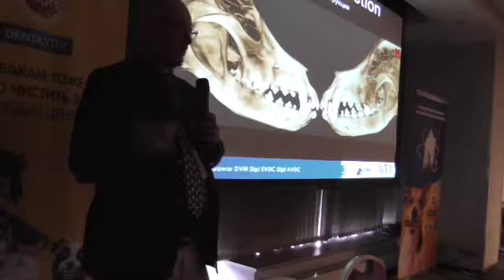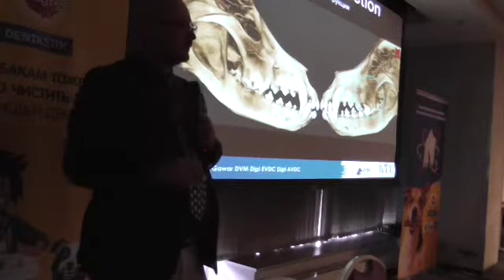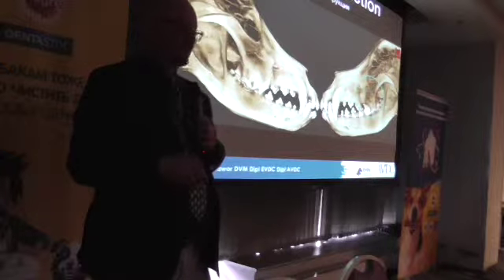And then it is again easier to explain on a 3-dimensional reconstruction rather than drawing or explaining on a textbook.